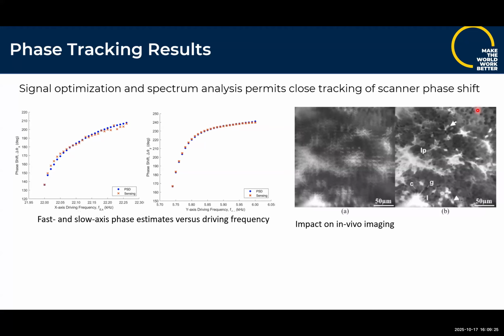On the other hand, usually these sorts of endoscopy probes are actually not used for that many patients. I think of them as a durable device, but they're really not. They do like 10, 25 patients with them and they're done. So I don't know where in the long term one does this, but there are benefits to being able to do this without putting any of your processing hardware at the chip itself.